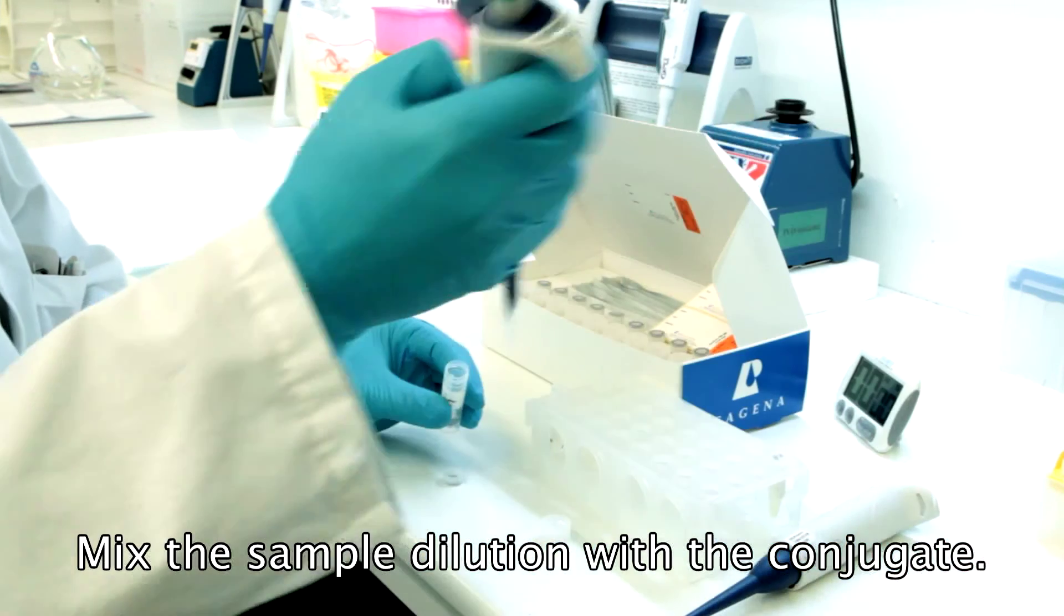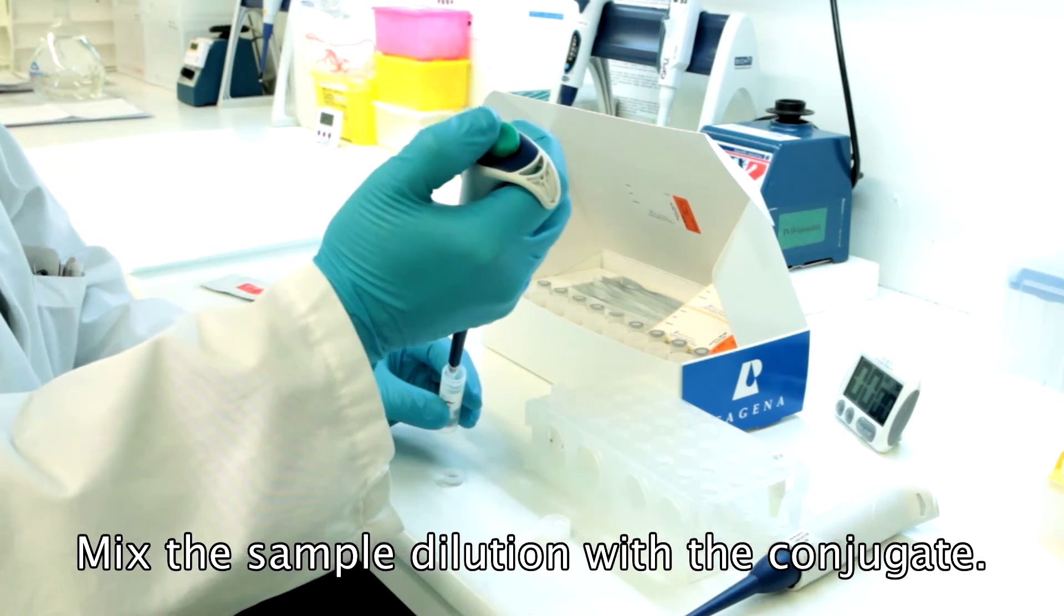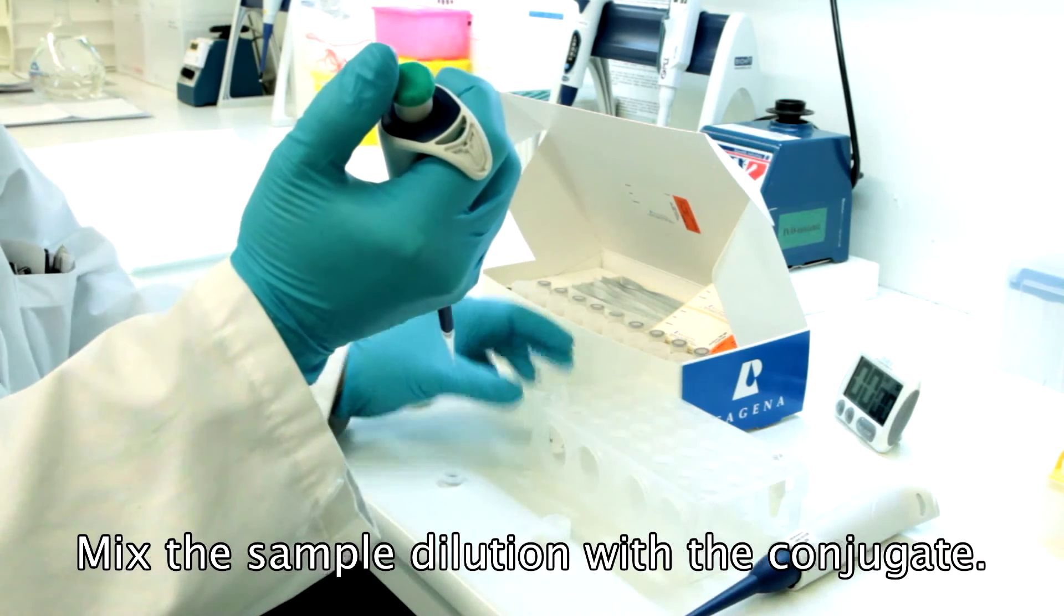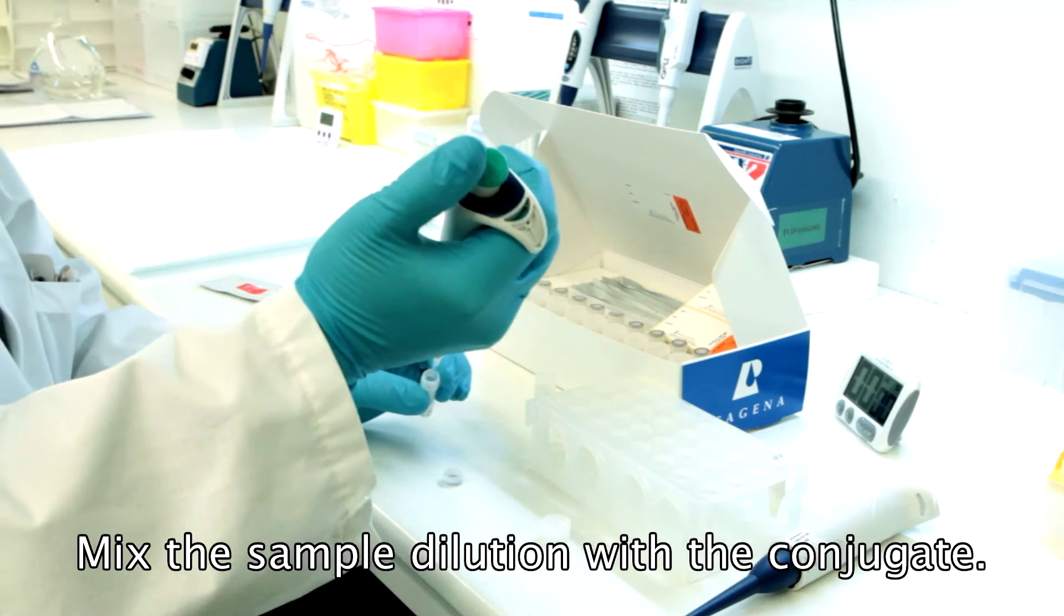Transfer 100 µl of diluted sample into the conjugate vial. Mix carefully by pipetting backwards and forwards until the conjugate is dissolved completely.